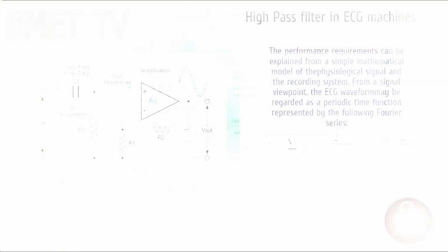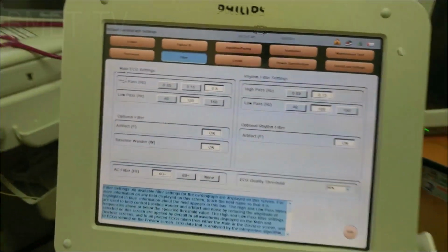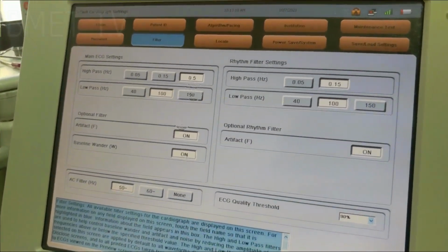The main intention of a high-pass filter in ECG work is to remove the DC offset, which in turn is largely caused by the electrode-gel-body interface. Unstable voltages of up to 300 mV DC can be produced. In diagnostic work, the patient can be asked to stay still so as to reduce these effects, allowing the filter corner to be reduced down to 0.05 Hz.